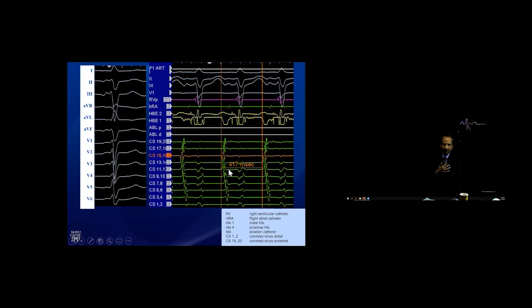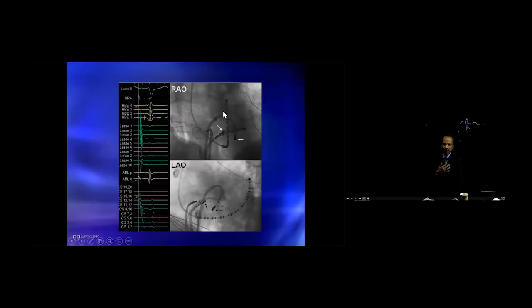We have a coronary sinus, we have a His recording catheter, and then we've also got a right atrial catheter. And if we then added also a catheter that you place in the left atrium, kind of opposite the septum here, we find something kind of curious.